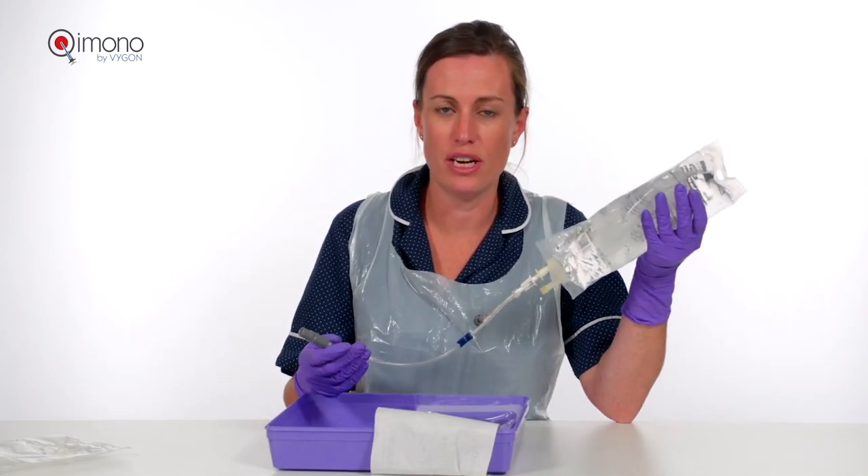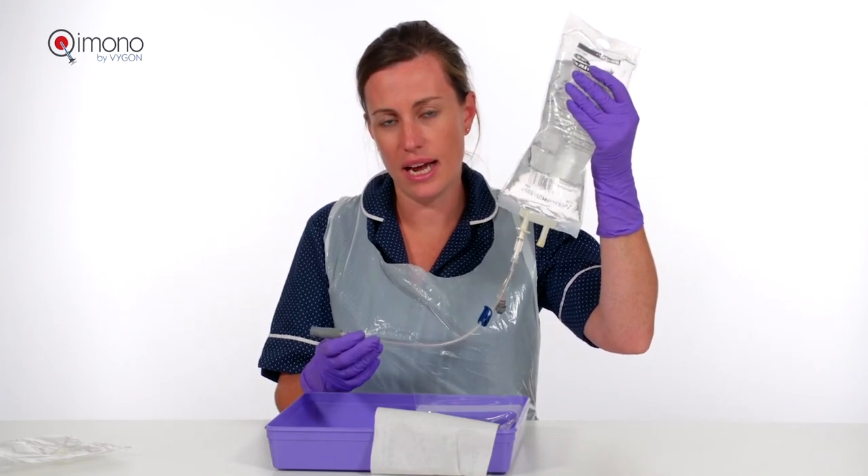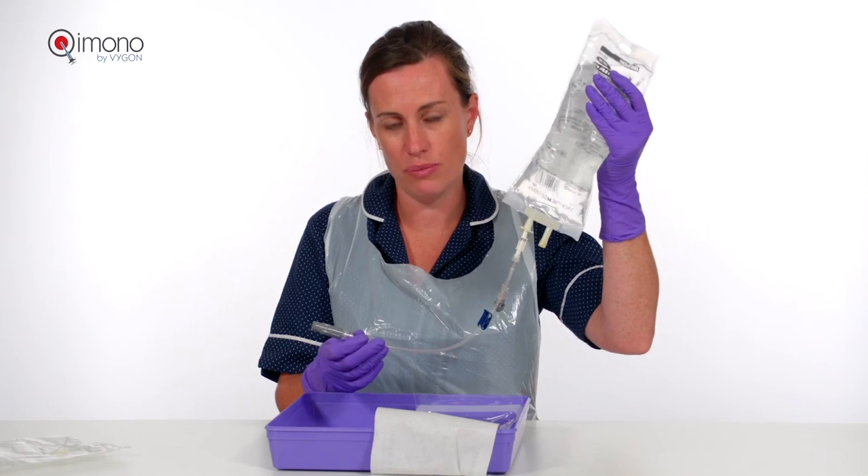This is now ready for administration. Please do not be concerned about the air in the line, as this will be removed in the administration process, which will be demonstrated next.